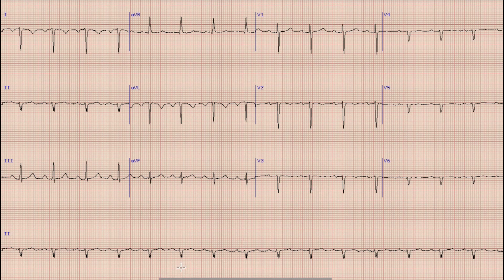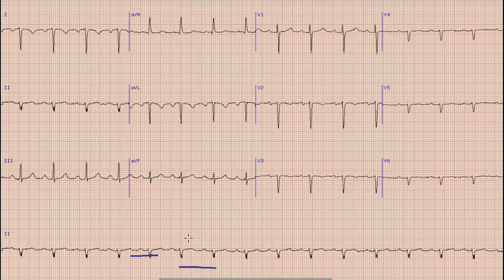As usual, the first thing we see in ECG is rhythm, assessed in lead 2 or a rhythm strip. As you can see in this ECG, there is an upright and prominent P wave before each QRS complex. So this is a sinus rhythm.